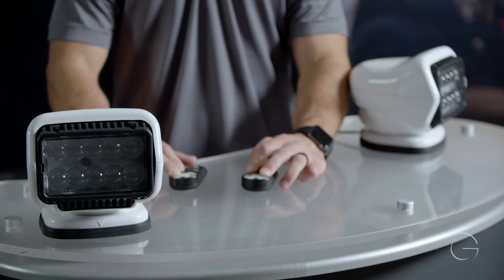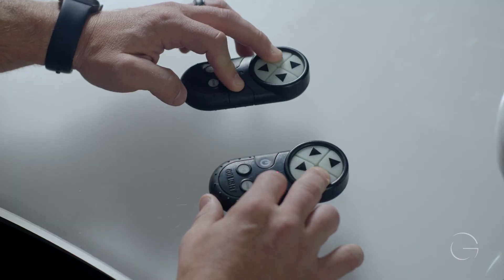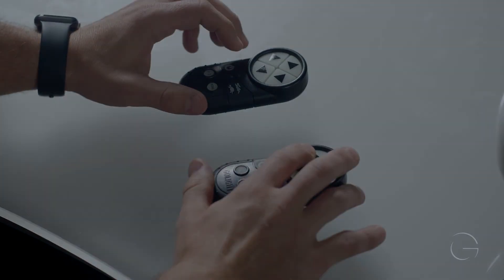Once the LEDs on both remote controls begin flashing, this signals a successful program duplication.